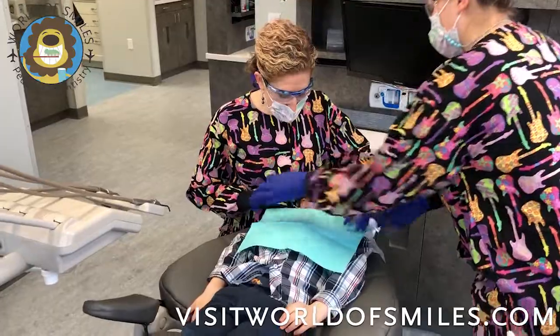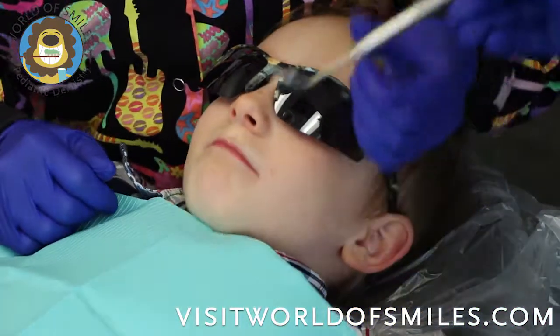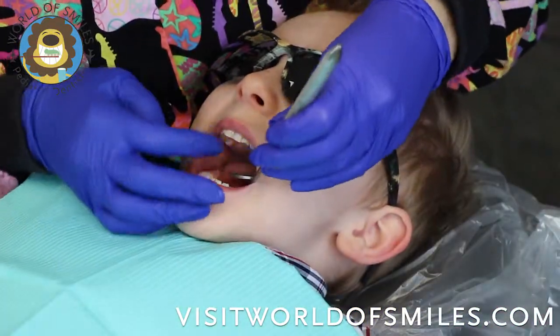First we'll cover our patient with the patient's bib to protect his shirt. Then I'll take a look — open the bib for me — good job.